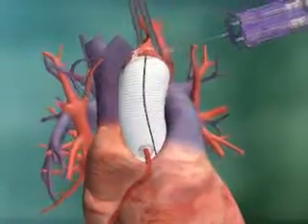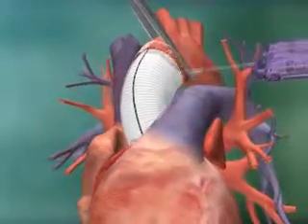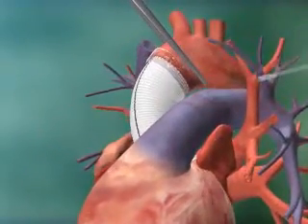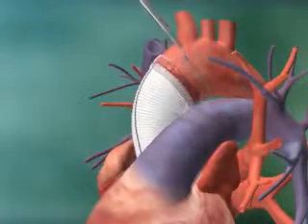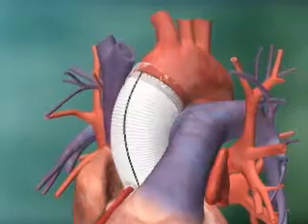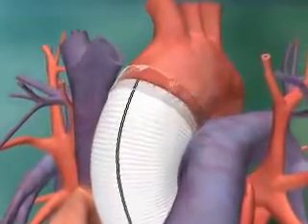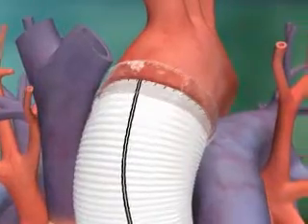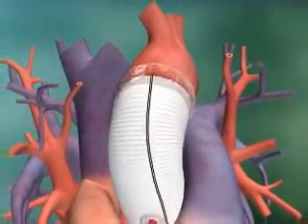CoSeal can be easily applied to the circumference of any anastomotic suture line. An additional benefit is its ability to remain very flexible. The flexibility of a surgical sealant is an important factor when considering normal physiologic dilation. CoSeal is more elastic than Dacron graft material, allowing it to easily flex with the pulsatile motion of the aorta.